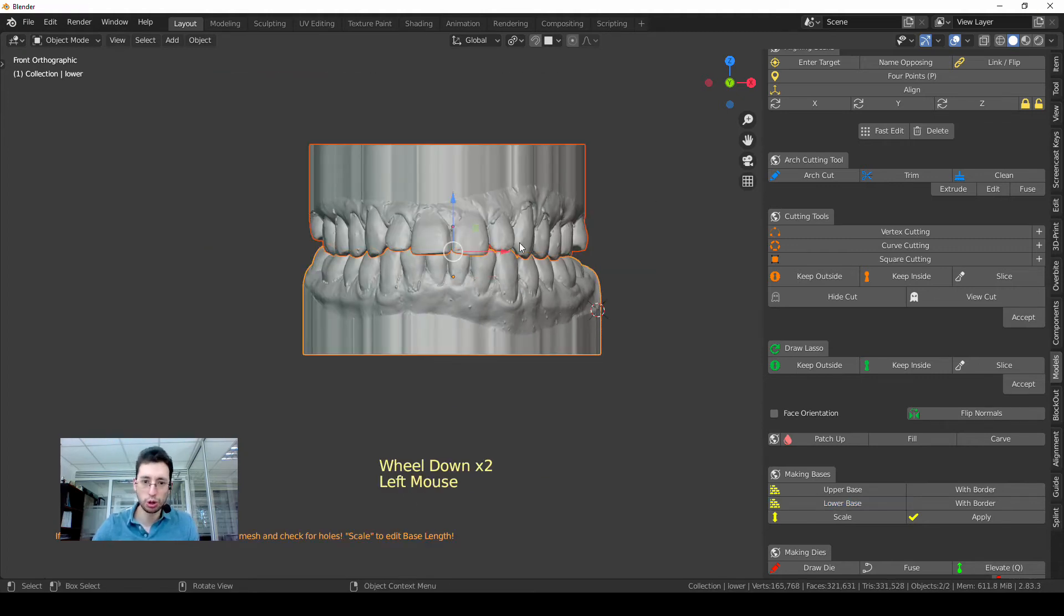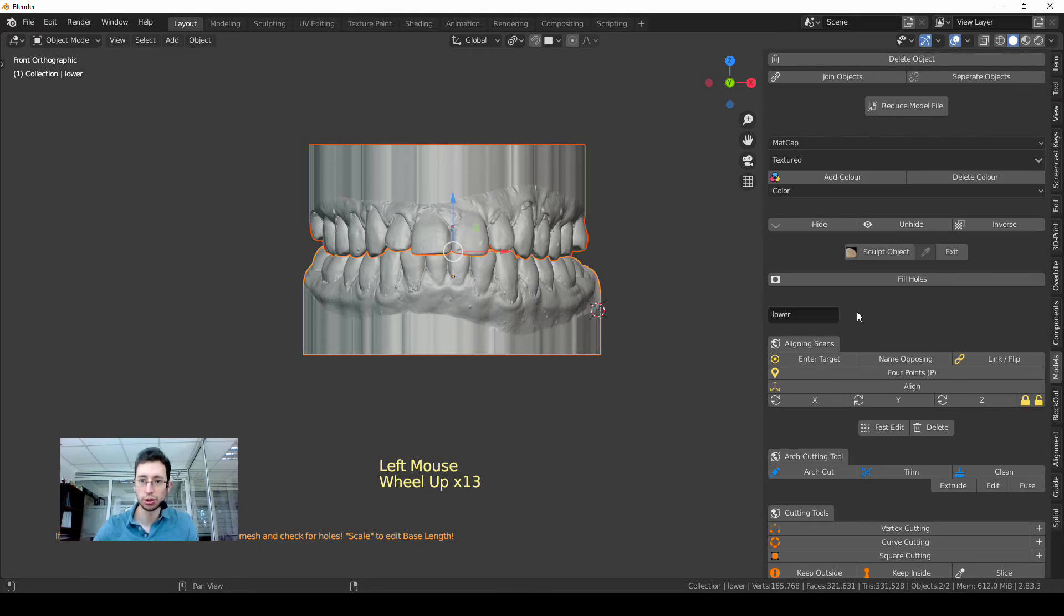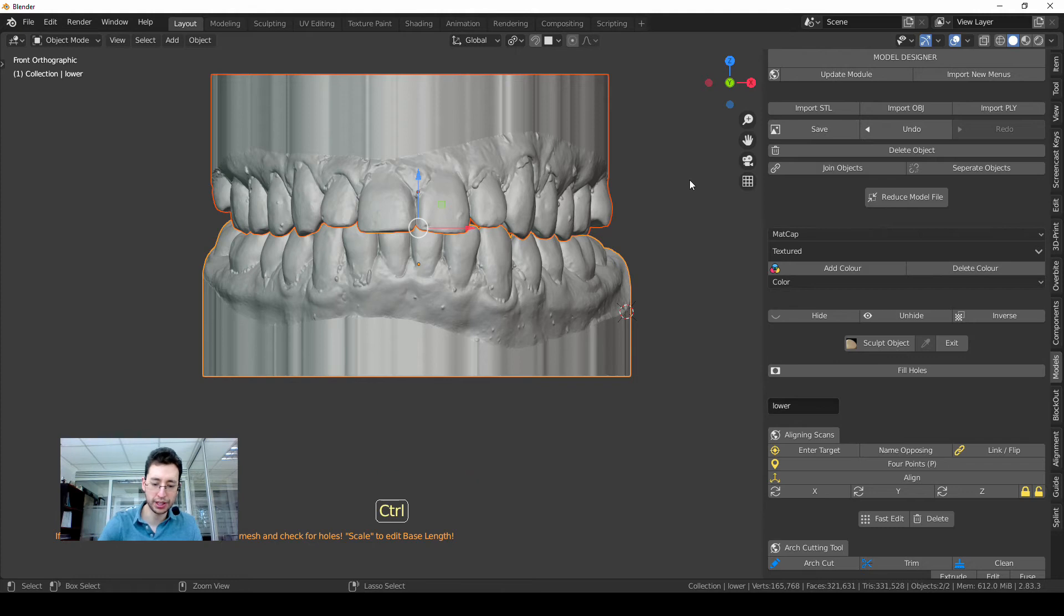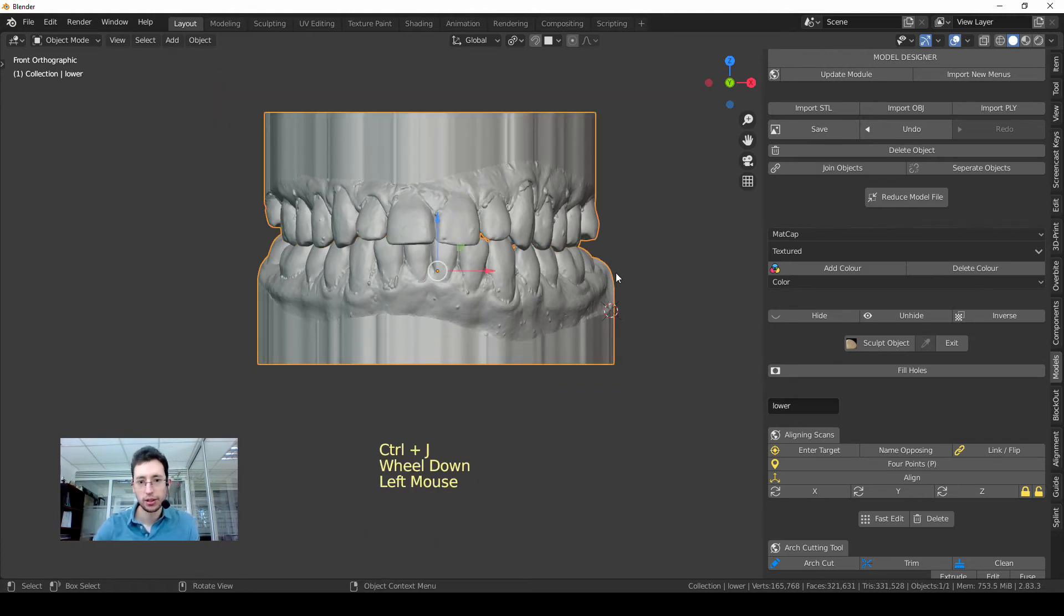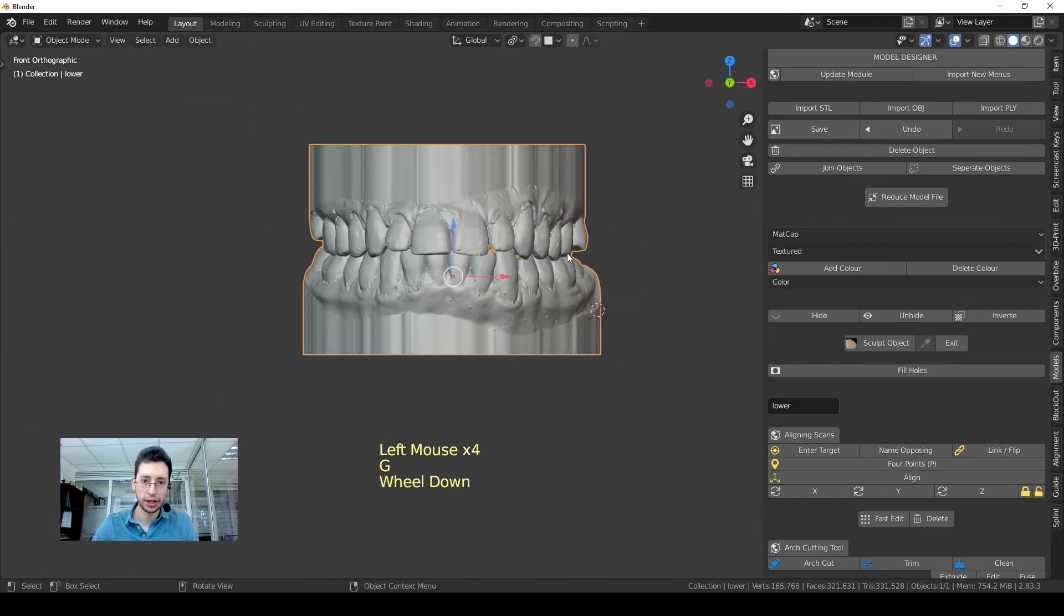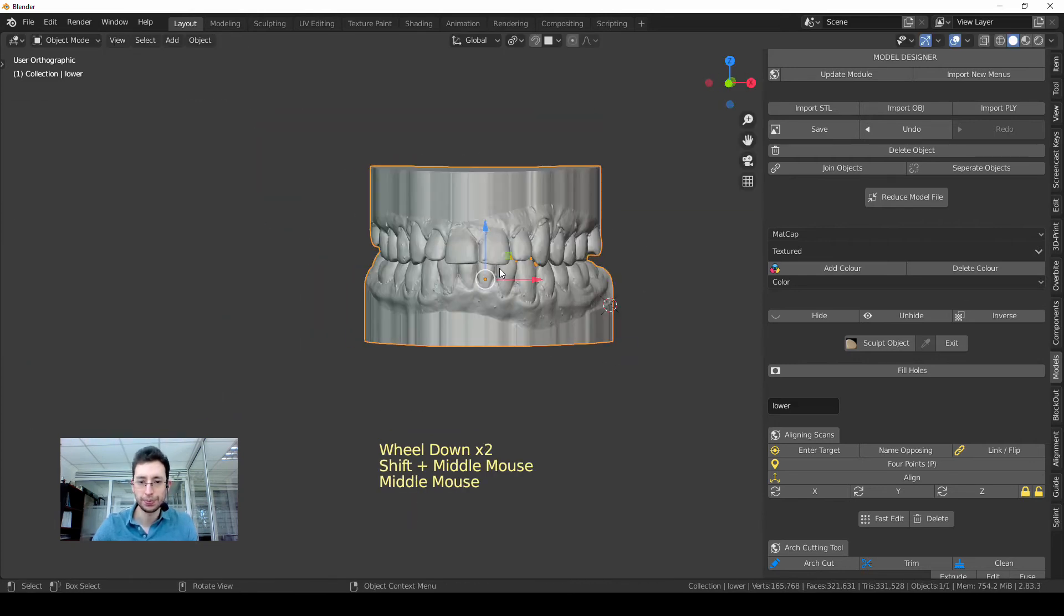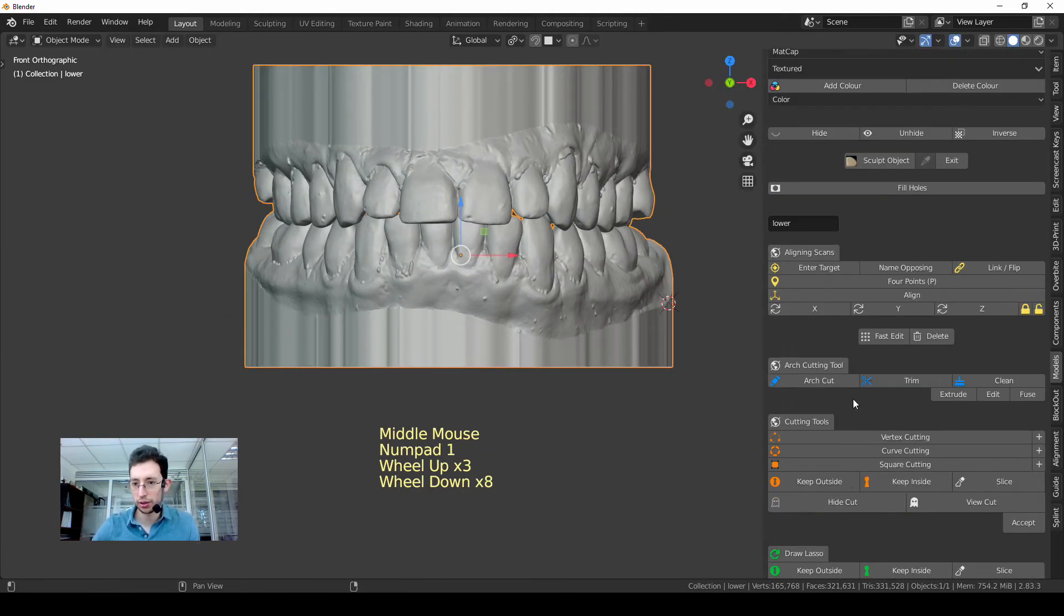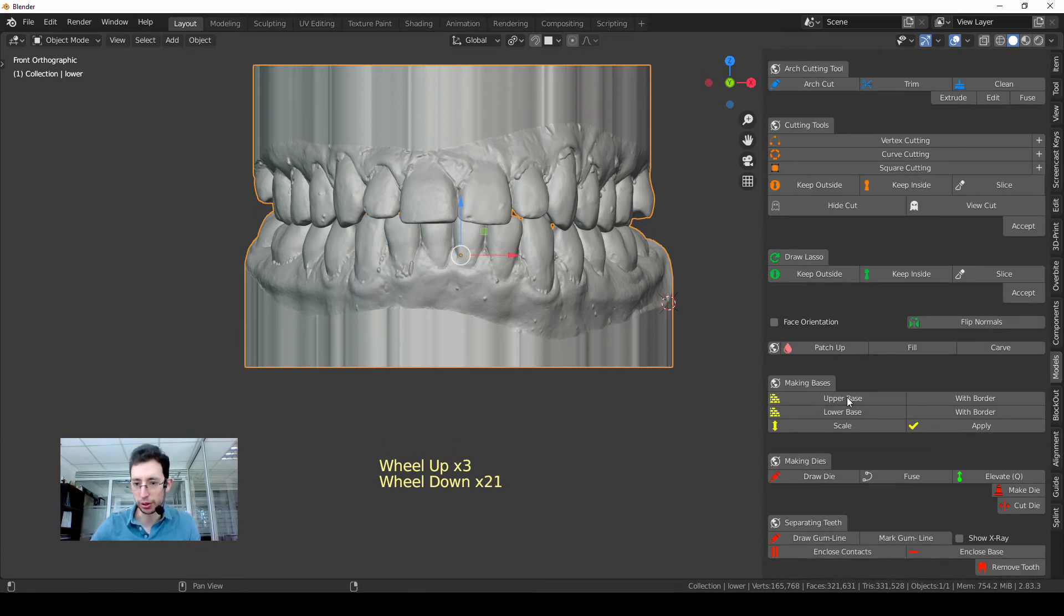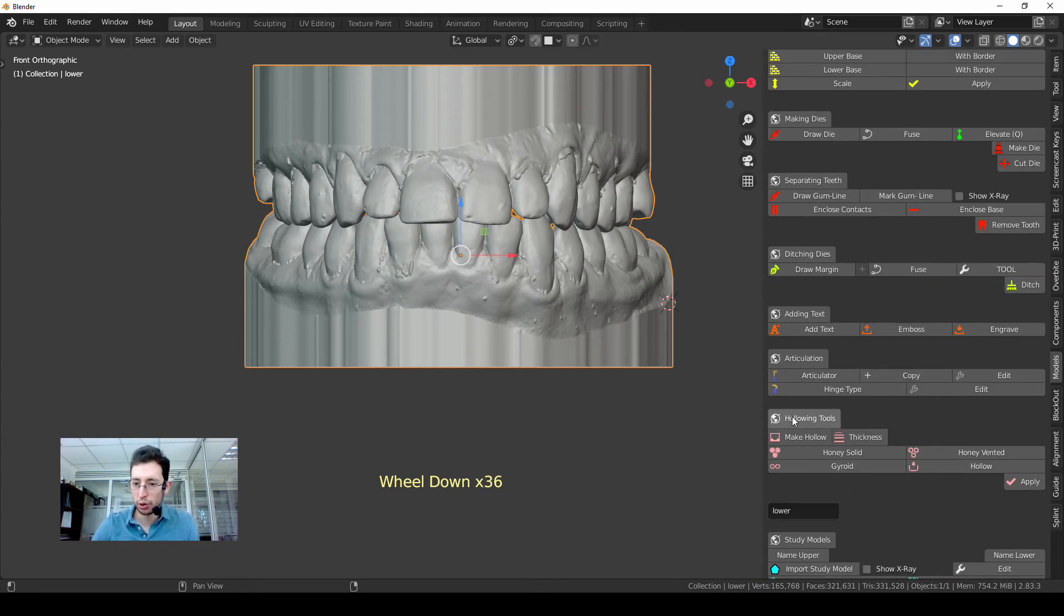Once I have the bases ready, next step is to join both objects in order to use the hollowing tool. It's very easy. You can use this button or press Ctrl and J, and now both models are joined. So I have a solid model.